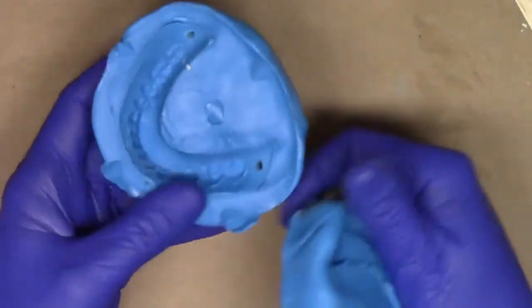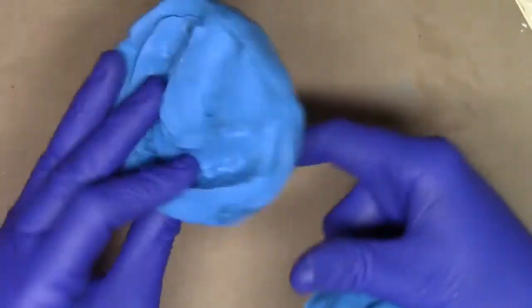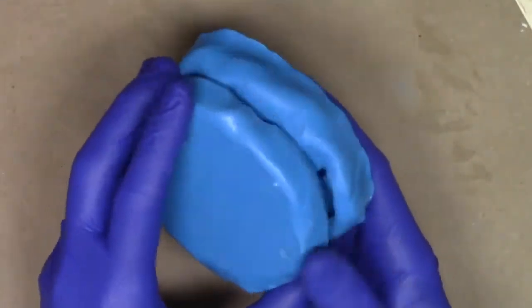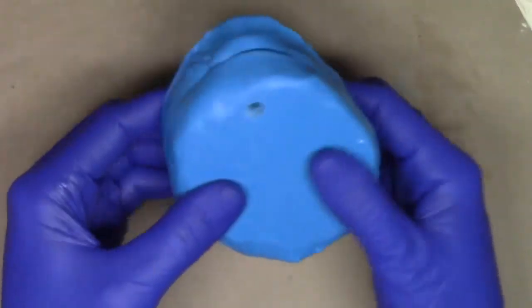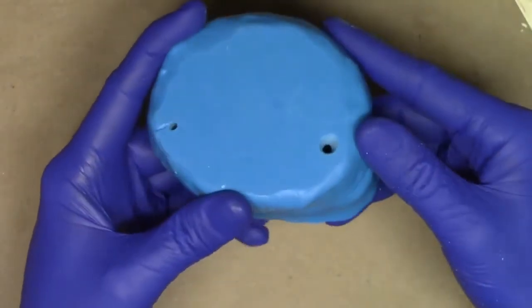Now we can see we have one larger hole and one a little bit smaller hole punching through the top portion of our putty duplicate. What we're going to be doing here is once I pour a little bit of resin into here and a little bit of resin into here, I seal it, tie it with a rubber band, and then inject the resin on one side, watching it come out the other side.